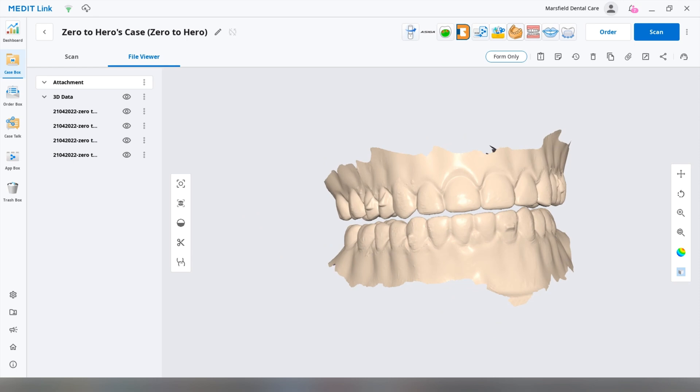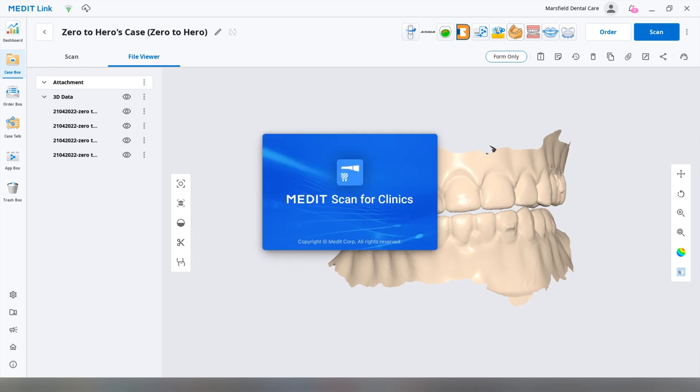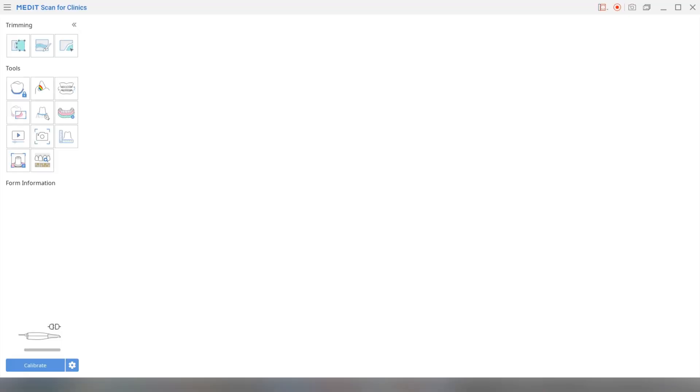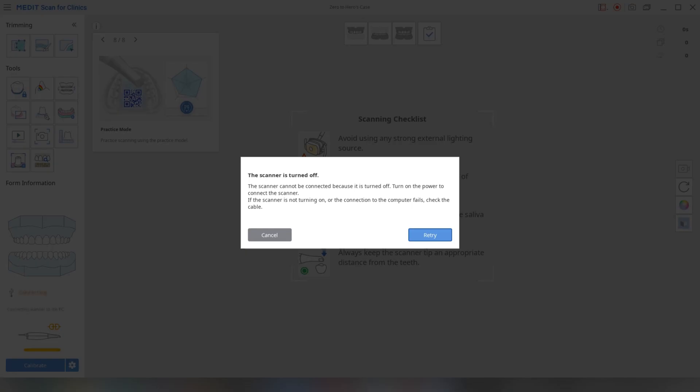Okay, so now that we've attached the files to the patient's profile, we need to enter the scan function. You don't need to, but if you want to use the model builder, you're going to have to register that attachment as an actual scan model. Because right now, you can attach any file, a photo, a JPEG, any file to the patient's profile. So the software is not smart enough to recognize that as the patient's actual scan. So you're going to have to do that manually using the scan software.